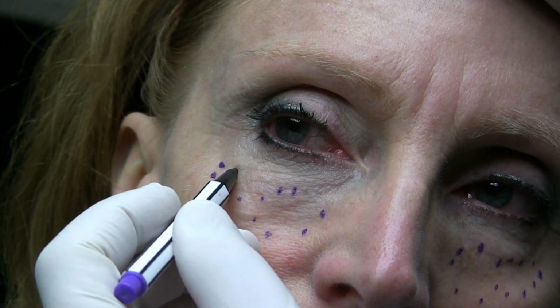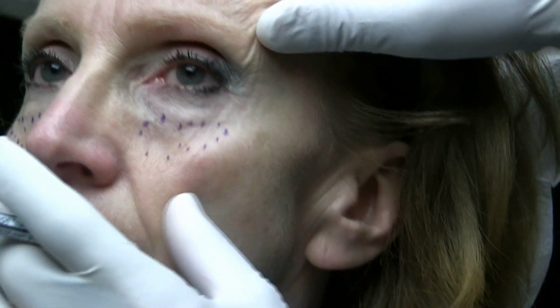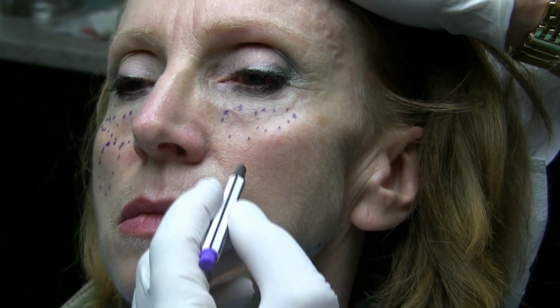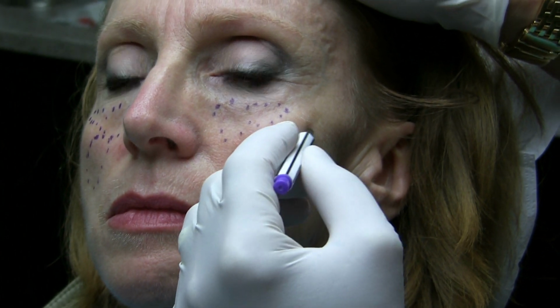And again, the big challenge with filler is generally the volume that you can use, and the limitation is usually expense. So these are the areas that we're going to treat, and then my secondary or tertiary area, depending on how much filler we use, would probably go down into this region.